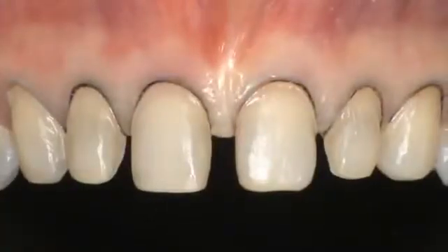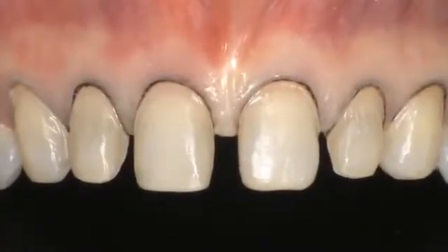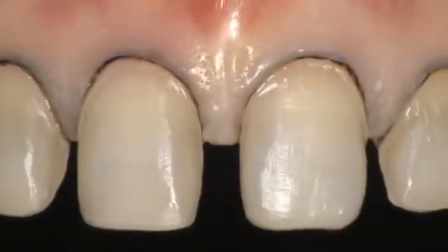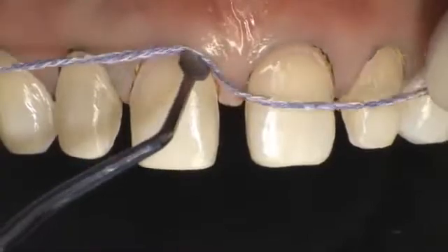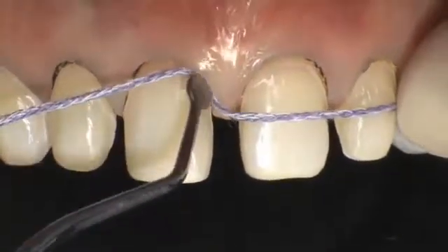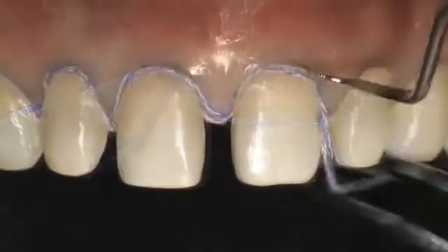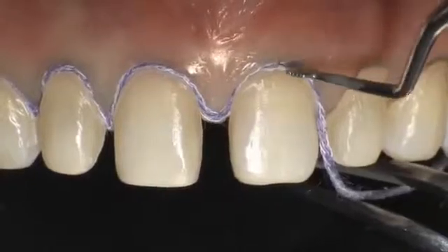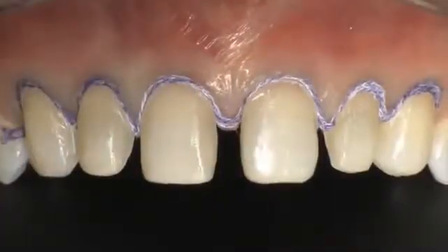A second cord, bigger compared to the first, will give the opportunity to open the sulcus and put in evidence the zone beyond the preparation. In this phase, it is really important to avoid traumatizing the soft tissue during the cord positioning.